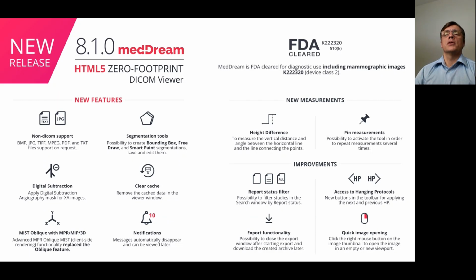Another situation was that it was really bandwidth consuming and server side consuming, which did not allow using it widely. So now we completed full coverage, and later on you will see even increased functionality in our oblique function. And as a bonus to all our users, we decided that in this upcoming year, this oblique function will stay free of charge for all our partners to migrate.